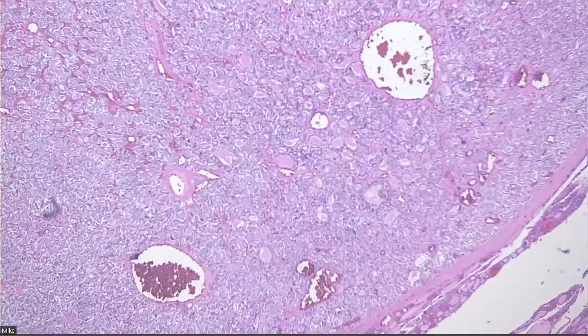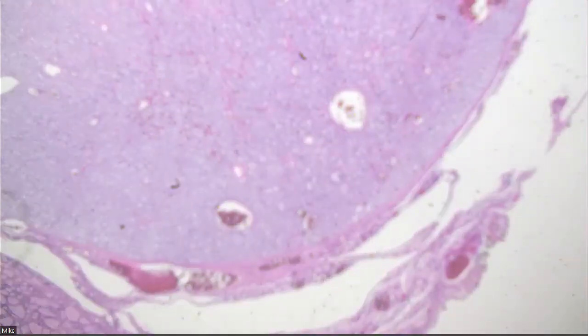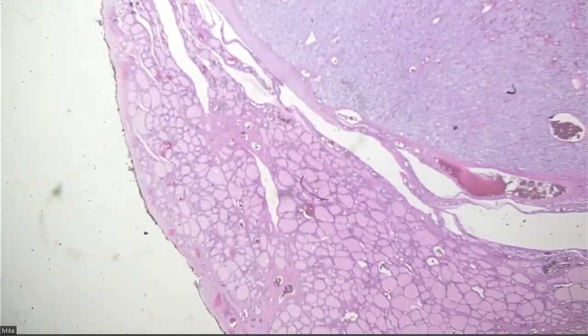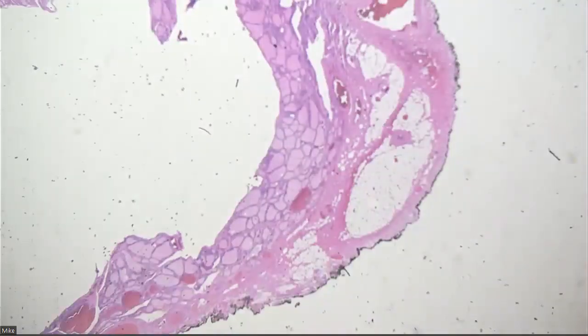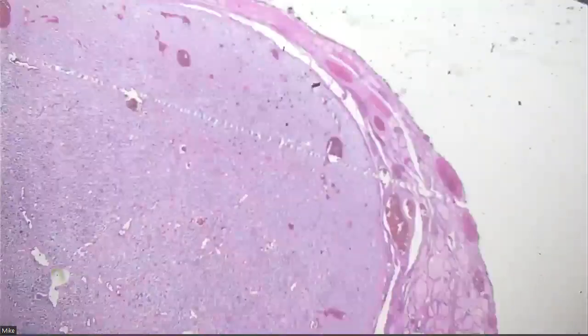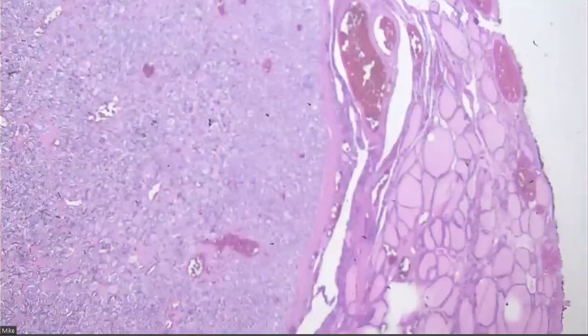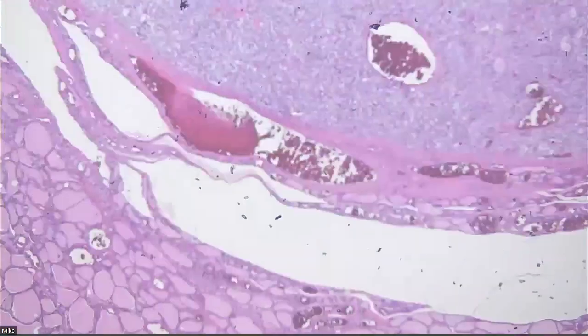All right, so 31-year-old female, 2.7 centimeters. Okay, so the challenge in follicular pattern neoplasms is always going to be trying to figure out if and when you can make a diagnosis of malignancy. The first thing you always want to look at is periphery. In this case, the periphery seems quite well circumscribed, or even perhaps very thinly encapsulated, even if not thickly encapsulated. Okay, so we're dealing with a circumscribed lesion.